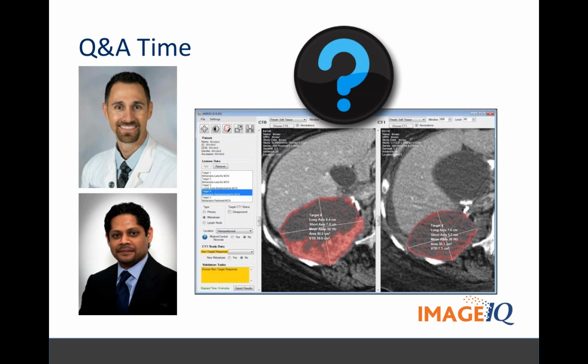Here's a good one. Are the vascular tumor burden ROIs based on the Hounsfield unit thresholding? Yes, that's a great question. It is, and it's kind of confusing because if you're measuring attenuation, like for Choi criteria, in one of our studies, we found that to be enormously unreliable. Interclass correlation coefficients of like 0.21, which is rather dismal. And so you'd say, well, how could you be so high in terms of your agreement with this? So what it does is you're actually measuring the amount of tumor within a threshold range. Okay, so that's actually very reliable. So if a tumor enhances 100 Hounsfield units versus 150, it's still the same amount of enhancing tumor.